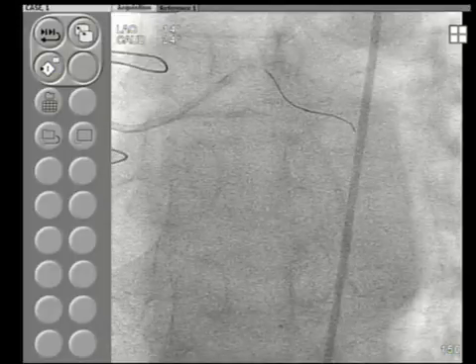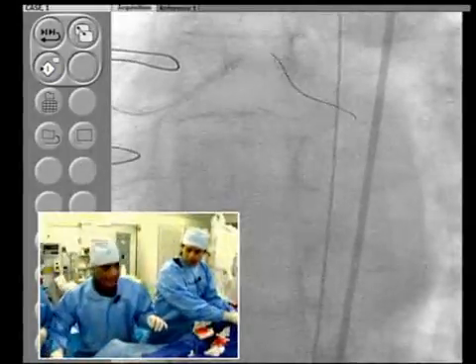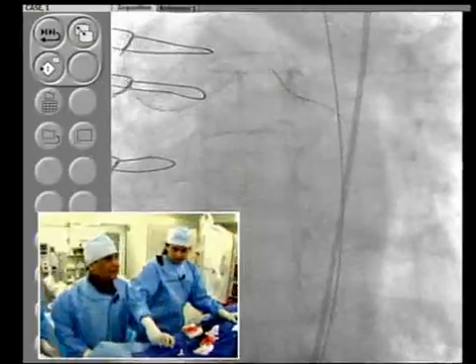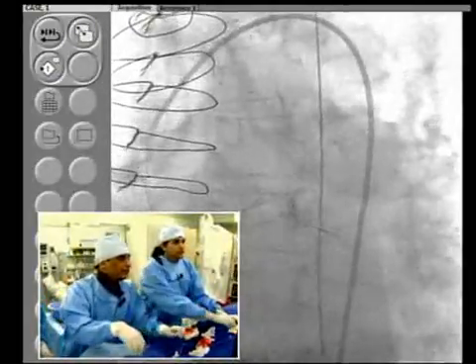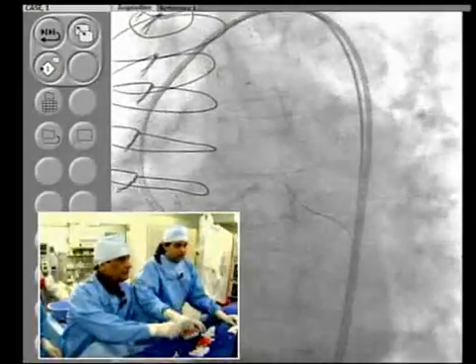Disconnect from there. And to me, one of the important advantages of the contralateral injection, once you're planning the total occlusion, is to just go with that. Don't change in the middle, because that will increase your success, because it will limit the distal dissection which you have created, if at all.